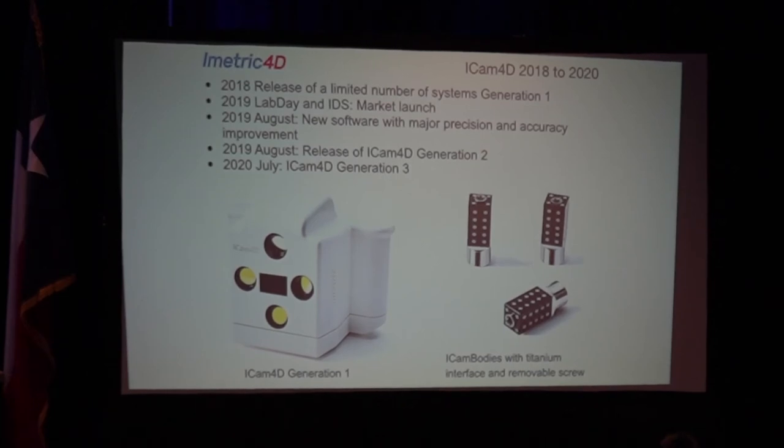But I'll tell you that most of you guys have probably heard about Pic more because they had all these, nobody knows me, right? So I was going on this trend because I was in the market the same way. So those are the reference bodies. The Pic, if you haven't seen, it's this big domino scan flag, but the base of it is all plastic. You can see going onto an implant on a multi-unit abutment, if you tighten it too much on a plastic, it's going to deform and you're going to lose a little bit of the accuracy. So everything on this system is designed a lot better in my opinion, but most people know Pic because they got all the big people around the world teaching for them.